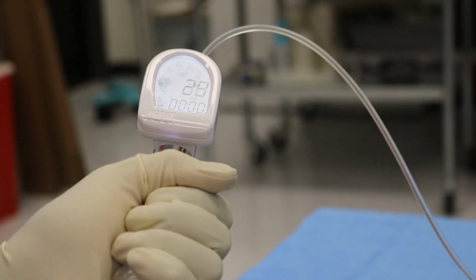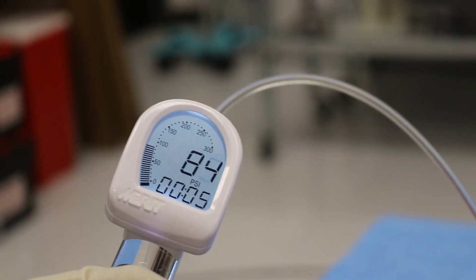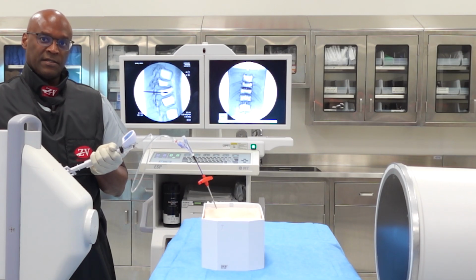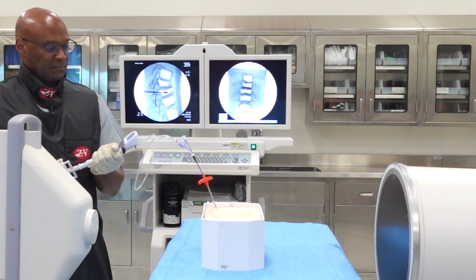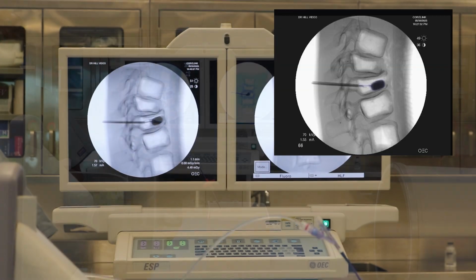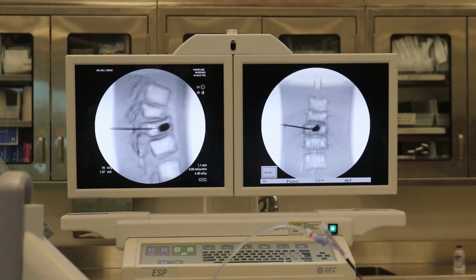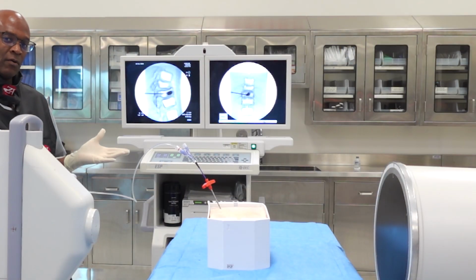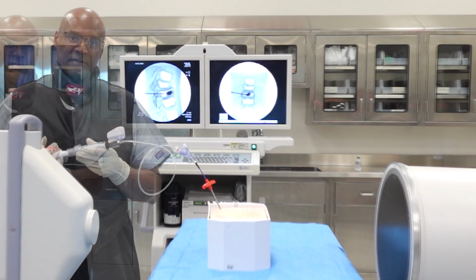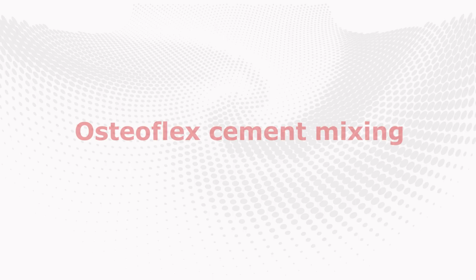As we start inflating the balloon, we follow the inflation using fluoroscopy. Limit of pressure, and we can see the balloons inflating into the vertebral body. And as you can see, we have a very good void fill with the balloon. Our pressures are not high, they're reading about 120 at this time. I think that's an adequate amount of inflation of the balloon, and our next step should be to deflate the balloon, and then we'll begin mixing the cement.